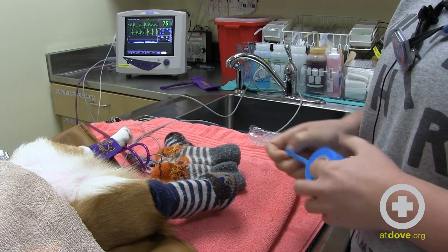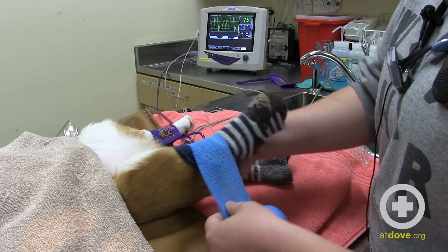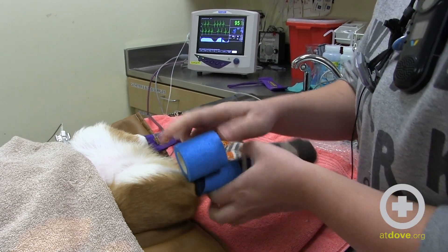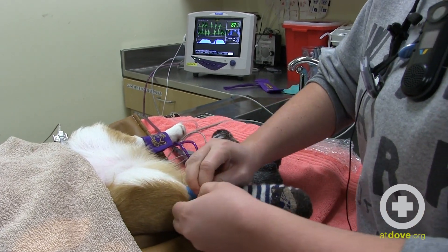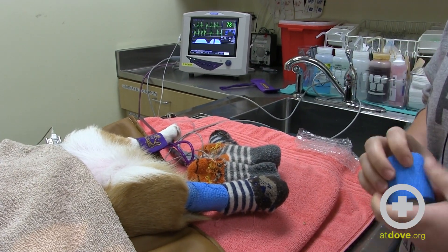Now in corgis or anything with short legs like little Cora has here, it's always best to wrap the top with vet wrap. You don't want it to be too tight, obviously, because we can cut off circulation that way. But on these stubby legs, these socks probably won't stay on without a little help. So I like to just wrap them with a little vet wrap, and you just repeat that for all four legs.